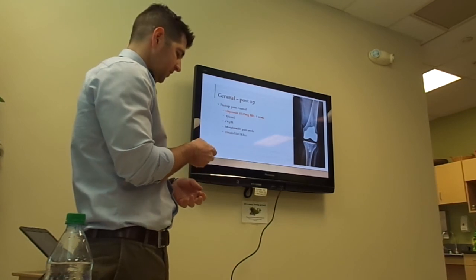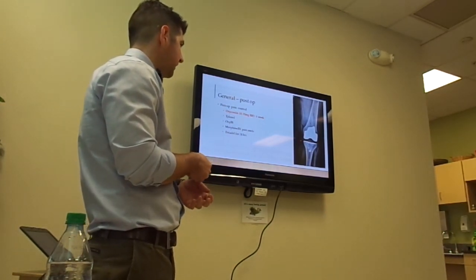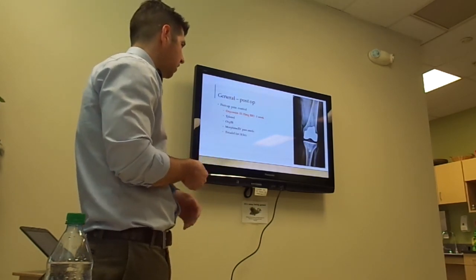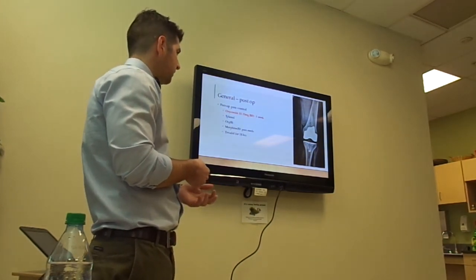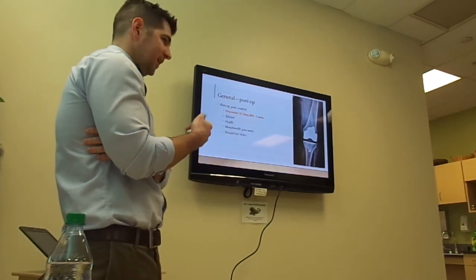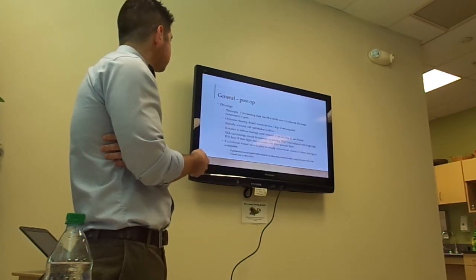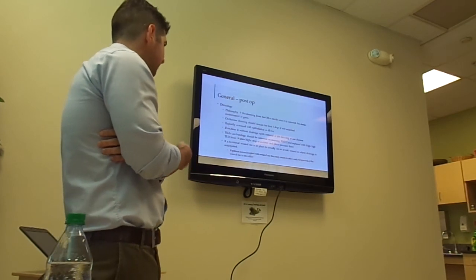This is one where this isn't a spacer. This is actually a total knee where we did not use a metal base plate. We used an all polyethylene tibia because this patient was allergic to metals. So this is an allergy-sensitive or safe metal that one particular implant company makes, and then I try and get an all polyethylene tibia in there so that it doesn't have nickel.